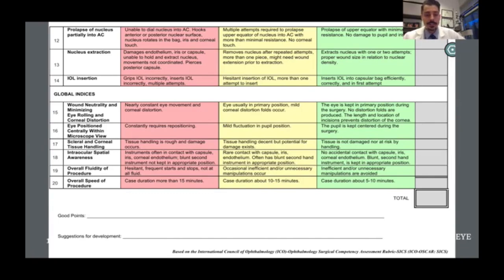It is a skill that, besides its low-cost benefits and good results, really can help in situations of problems with phacoemulsification. I actually use manual small incision cataract surgery when things get pretty hairy in my cataract surgeries now in my practice.